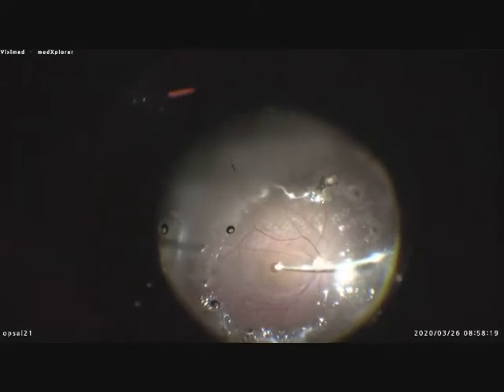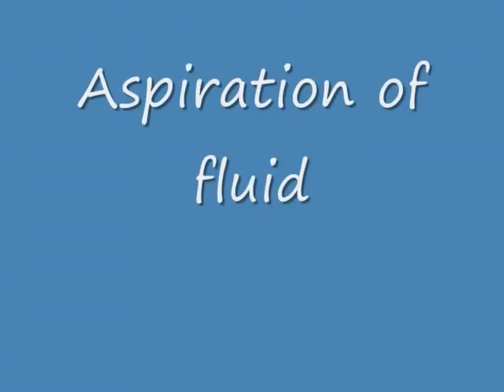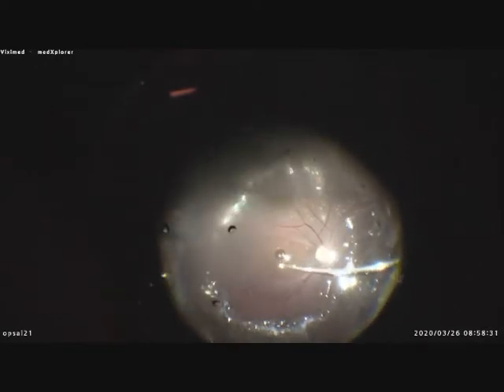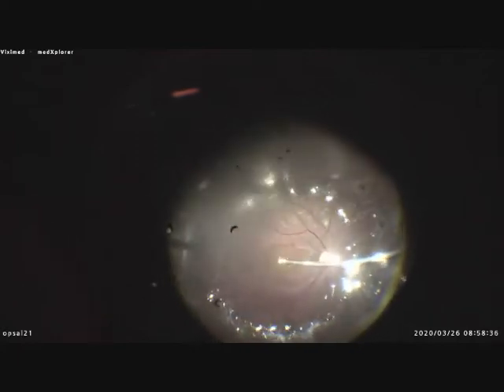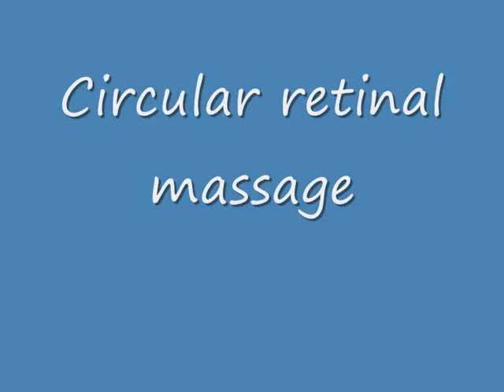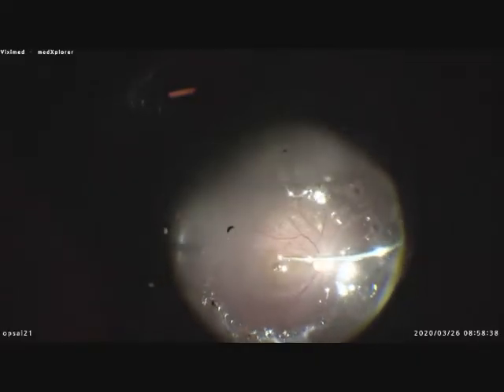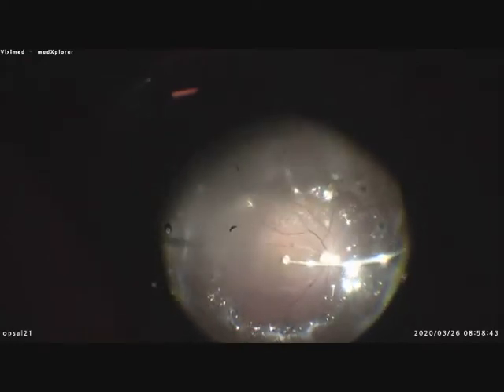This is an air-filled eye, and I aspirate fluid from the macular hole. Then I perform a circular retinal massage. You can see that the hole is getting smaller and smaller.